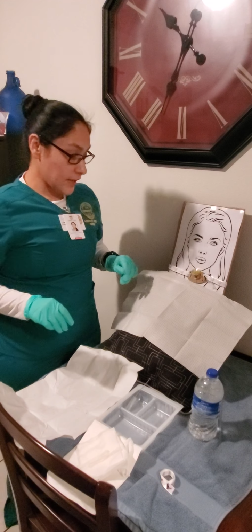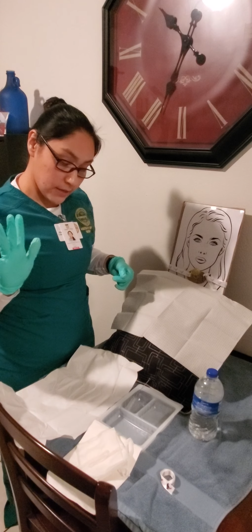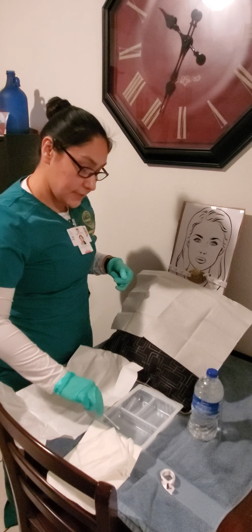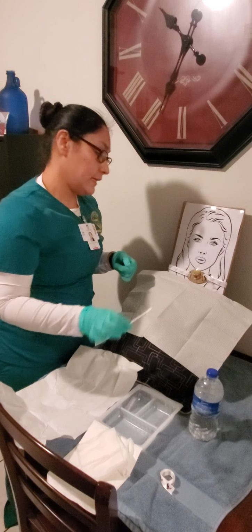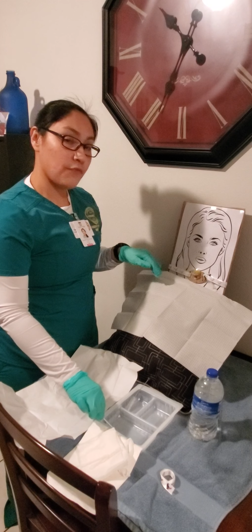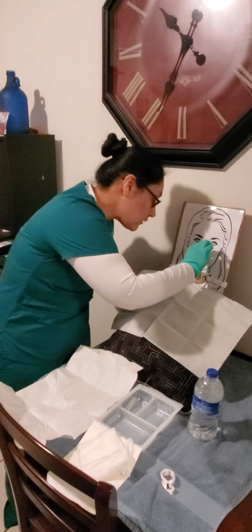Okay, so once the inner cannula is in, you can go ahead and proceed to cleaning the stoma and the faceplate. So with your dominant hand, you're going to go ahead and pick up a cotton tip applicator, dip it into the normal saline in the third tray, and you're going to clean. So the way that we're going to clean is we're going to start with the area above the faceplate and then followed by the area below the faceplate. So with my non-dominant hand, the tip applicator, we're going to dip it into the normal saline. And we're going to go ahead and start.